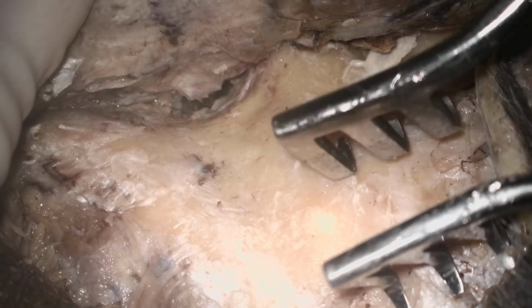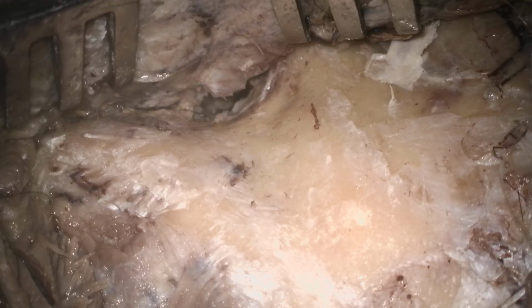drilling for cortical mastoidectomy. Okay, so now in this patient, after elevating the soft tissue flap, put your mastoid retractor in the superior part, because this is a larger flap and the length of this mastoid retractor will not be sufficient if you apply it in the middle point. So that's why you have to apply the retractor in the upper part and maybe sometimes in the lower part if you continue dissection in the tip cell area. So now we will start dissecting for the cortical mastoidectomy.